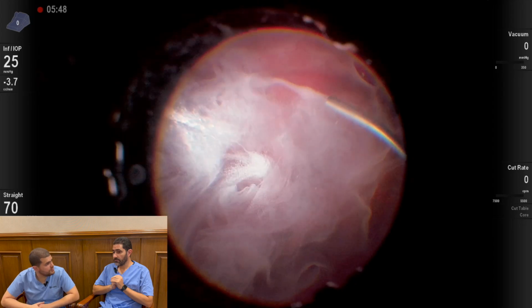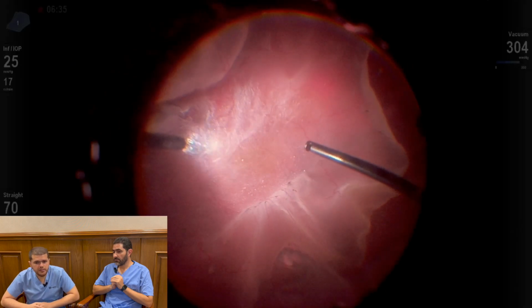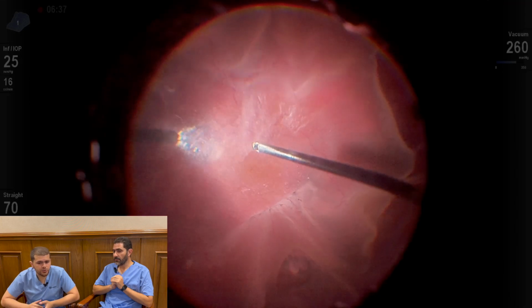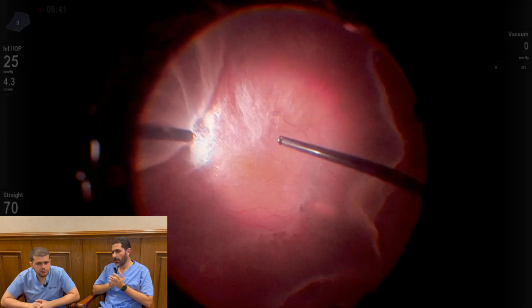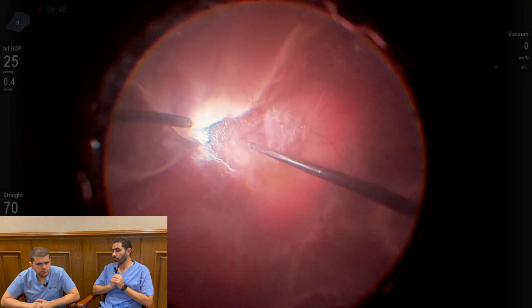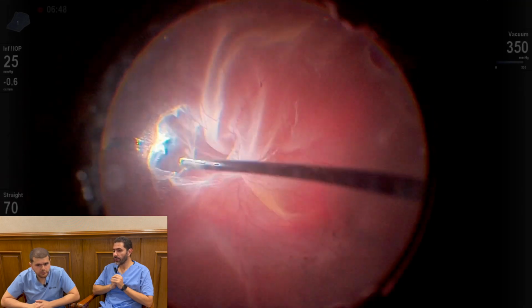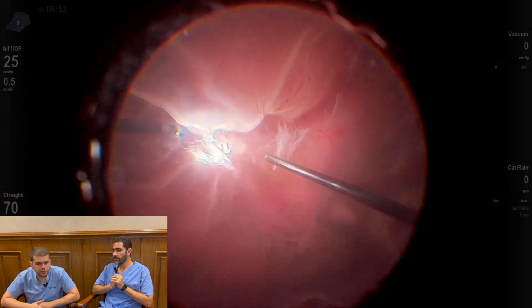It's a non-PVD detachment with multiple retinal tears, and no history of trauma. So, yes, I believe it's a typical syndrome, whether it's Stickler or another one, with this large GRT and multiple small tears and these pigmentations, and definitely the absence of posterior hyaloid detachment.